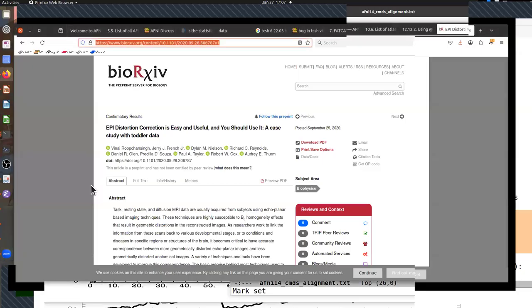Well, the main thing is I don't want to remember. I want to have the check. That was the main point. I intentionally don't remember, so I don't want to fool myself into a mistake. The other important point is that that was initially discovered by an AFNI user in one particular data set, and the result is a script that quantifies it to make it more automated.